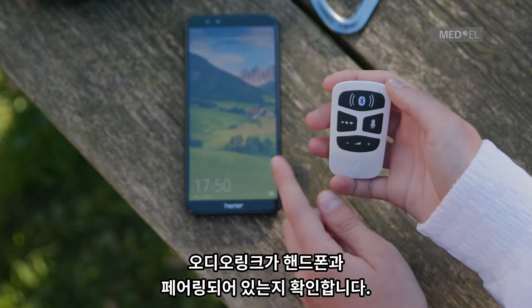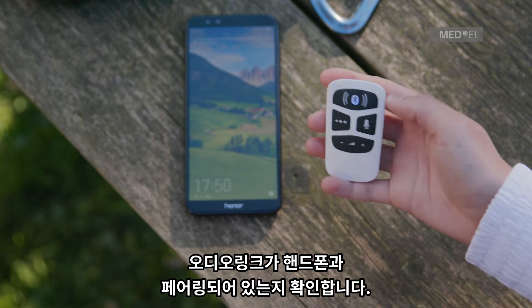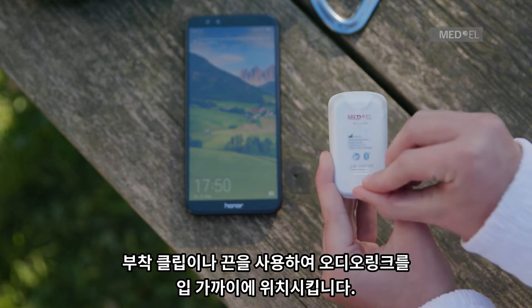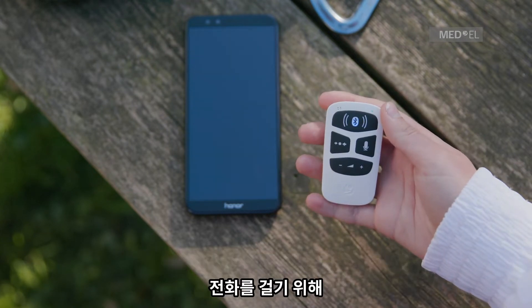Make sure AudioLink is paired with your phone or other Bluetooth device and is active. Use the attachment clip or lanyard to position AudioLink close to your mouth.